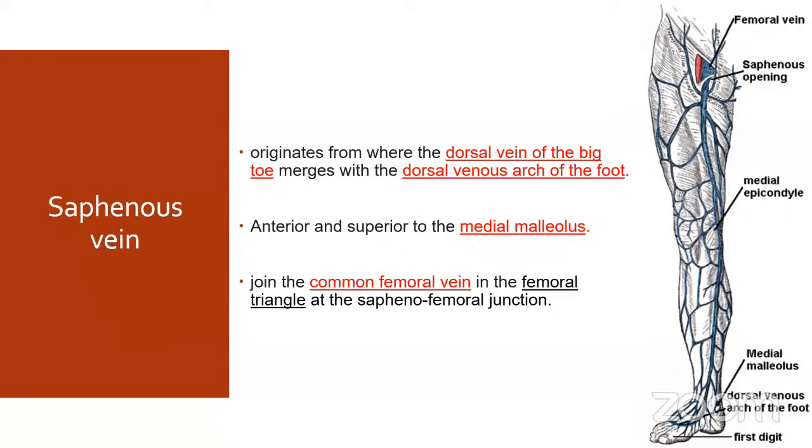One thing you can do to avoid this variation in anatomy is to do venous mapping before the surgery. But we don't usually do it. This luxury, we couldn't find it in all hospitals. I have never done it unless the patient has DVT or a history of DVTs. Otherwise, we just go on and do it anatomically.